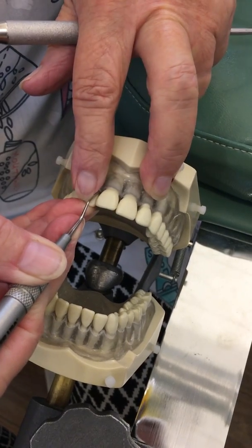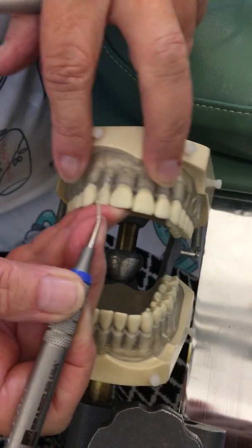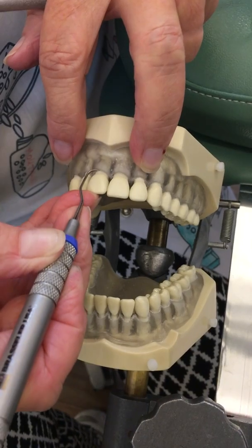As you come around the corner, you want your shank parallel with the long axis. I have to lean my hand in that direction — not stretch my fingers — and move my fulcrum as I move.